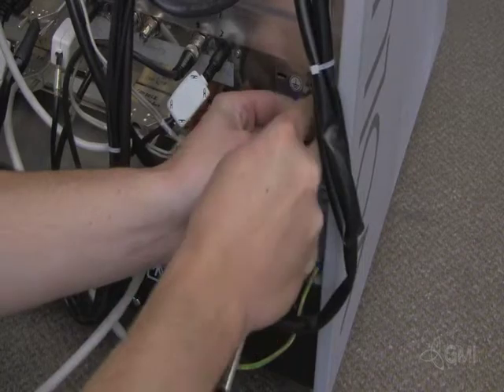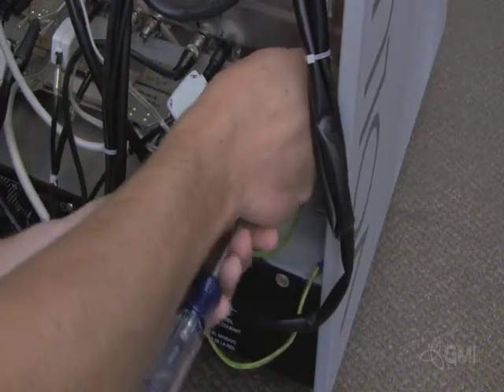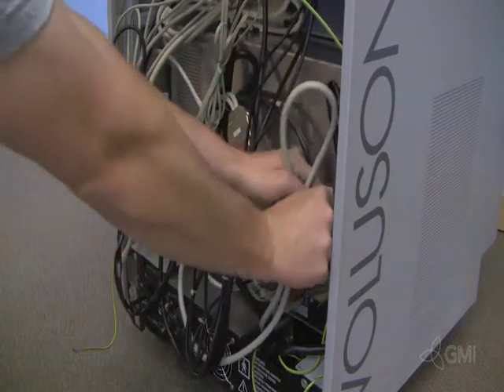Secure the ground cable to the e-box. Secure all cables neatly in the chassis. Use zip ties if needed.